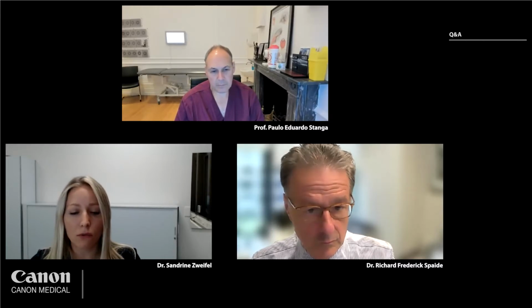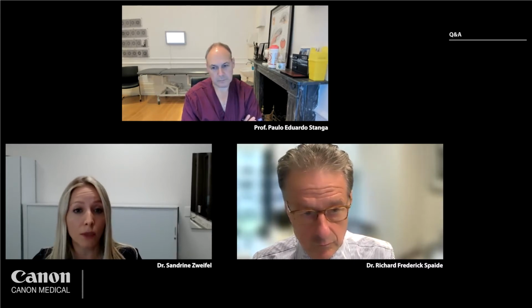Maybe the lower resolution has something to do with that. For example, for the OCTA, they just rescan twice, whereas for other devices you do more than twice. But of course, it's a larger field. So you have 23 by 20 millimeters in just one single scan, and the larger field you have, the longer it takes. And when it takes longer, there is a higher risk of artifacts due to patient movement.